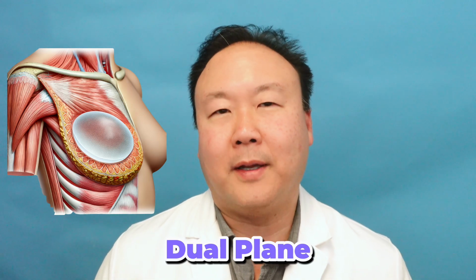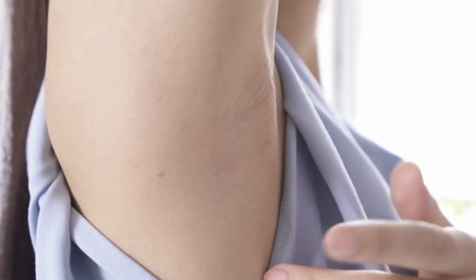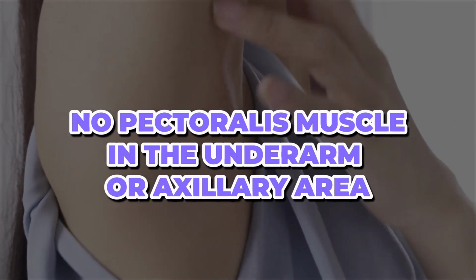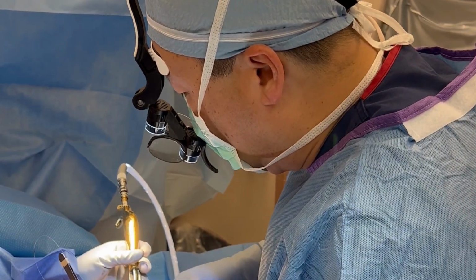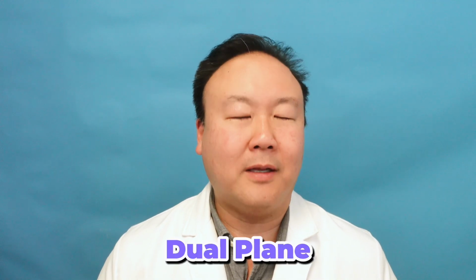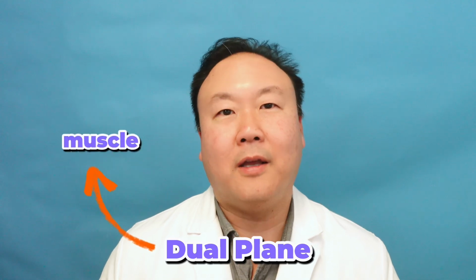So why do we call it dual plane? Now, you may remember I told you that the pec muscle isn't like this big vast sheet of muscle that covers the underarm. At the underarm area, it actually thins out and becomes nothing. There is no pec muscle in the axillary underarm area. Technically, when I'm creating a circular pocket for the implant, yes, I'm pretty good under the muscle, sort of in the middle, but towards the sides, the lateral edges, the areas going towards your underarm, you have no pectoralis muscle coverage. So there are two planes, a dual plane, covering your actual breast implant, the muscle and your soft tissue.